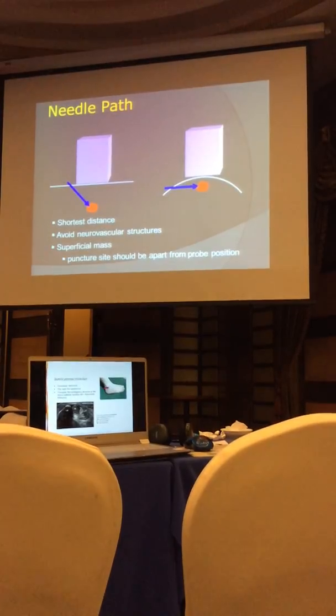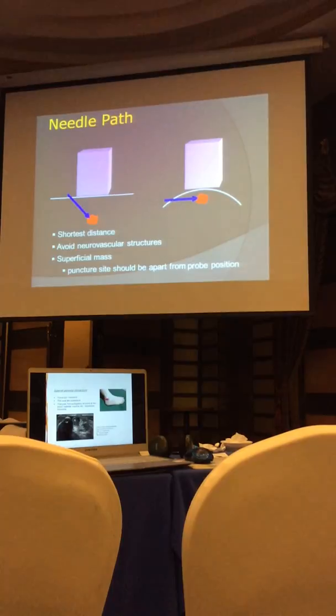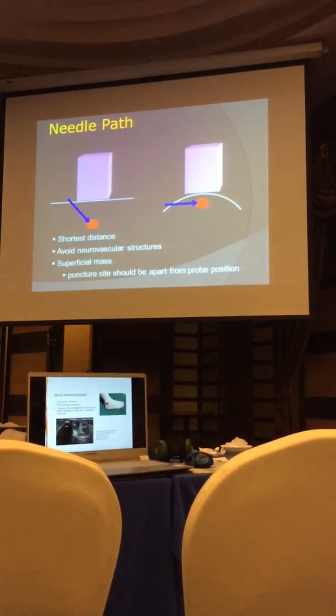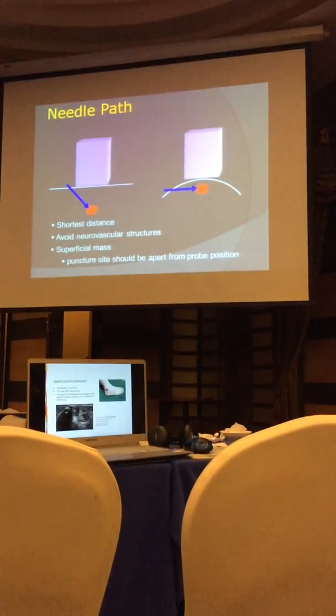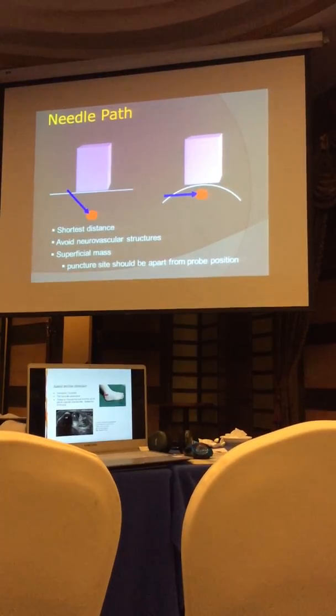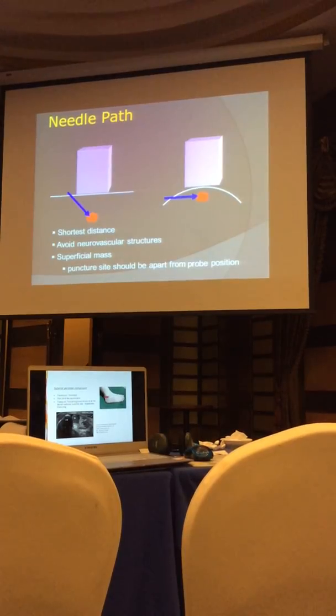For the needle path, try to secure the shortest distance. Also, you have to avoid hitting neurovascular structures. You can confirm the presence of vascular structures by using Doppler exam if necessary. For superficial masses, the puncture site should be apart from the probe position.